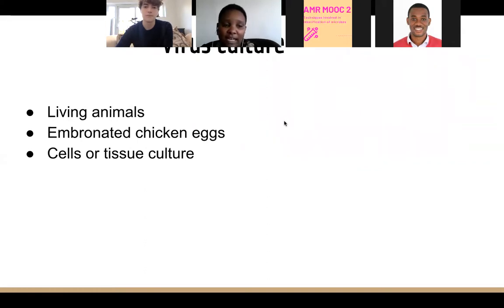We have living animals, like lab animals, mice, rats, rabbits, any animal that you decide to use to grow your viruses of interest. But we also have embryonated chicken eggs. This also can be used to grow viruses. We have cells and tissue culture.